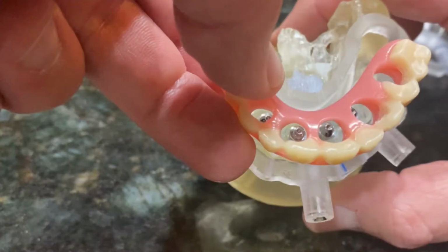This picture shows how well the temporary teeth line up with the abutments on the model, so that when it's time to refine that temporary in the patient's mouth, everything moves ahead very smoothly.